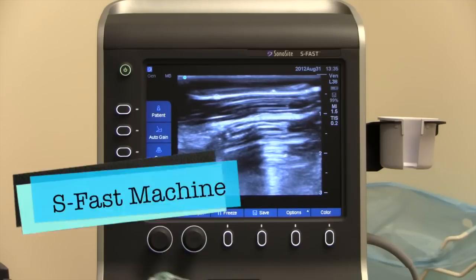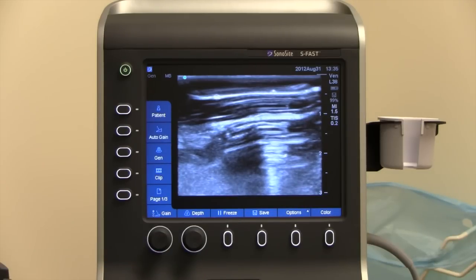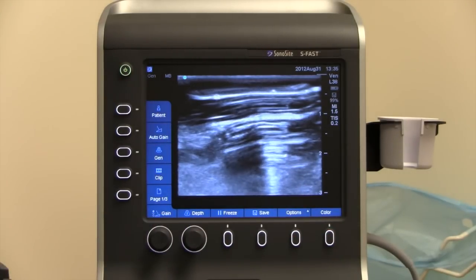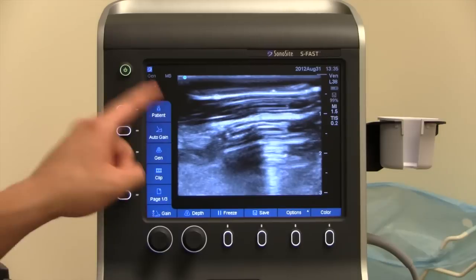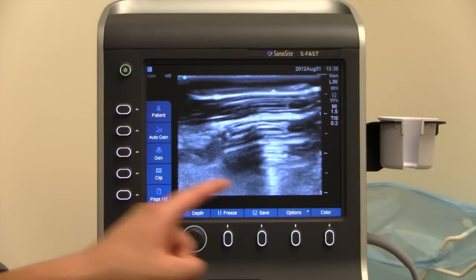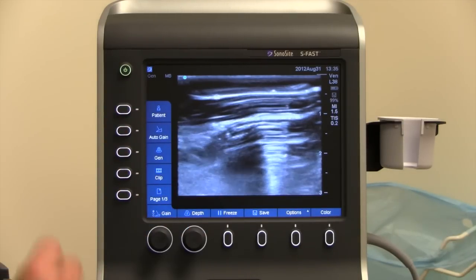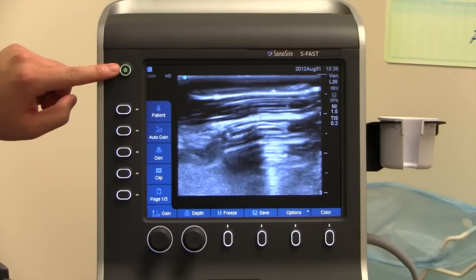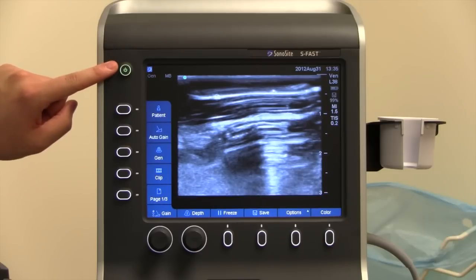The other machine we have is called the S-Fast machine. This machine is different from the M-Turbo in the fact that it has fewer buttons. The buttons are all surrounded around the periphery of the monitor. Don't touch the screen — it's not like an iPad, you don't need to touch anything to change the options. The five buttons are the same that you need to know. One is the power button, which is on the top left-hand of the S-Fast machine.